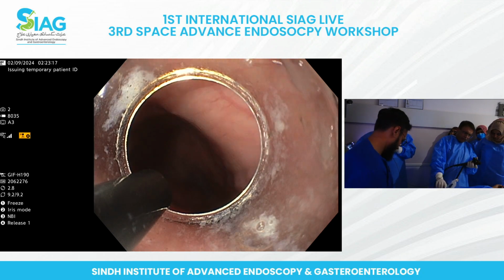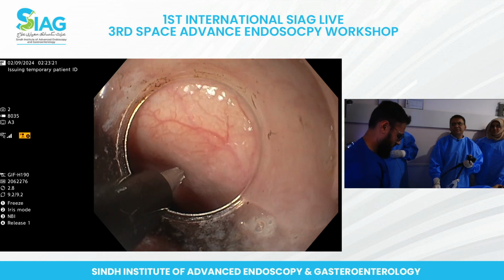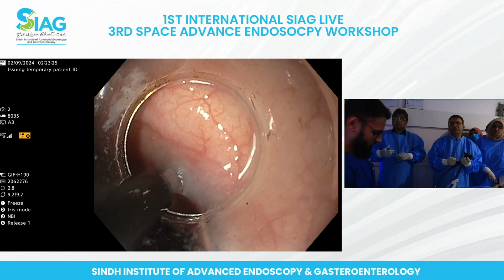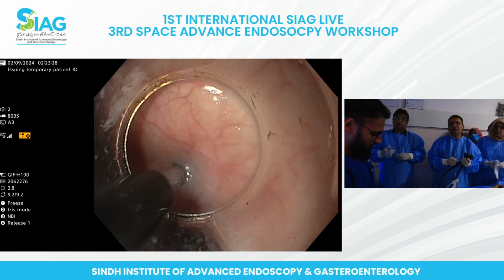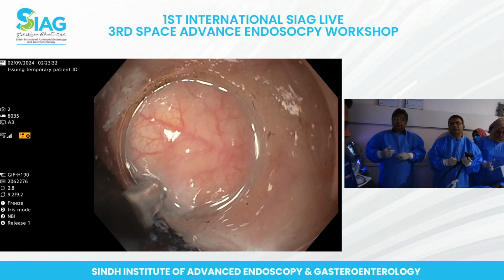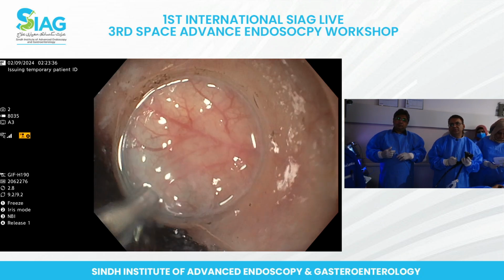I'm starting at 41. Up, you're seeing, almost. Yeah. So needle into the patient. Okay. So go ahead and slowly start injecting. Inject slowly. Yes, keep going, keep injecting. Good. Keep going.